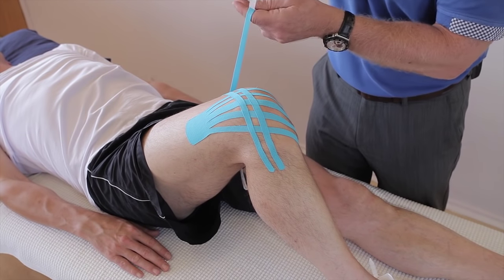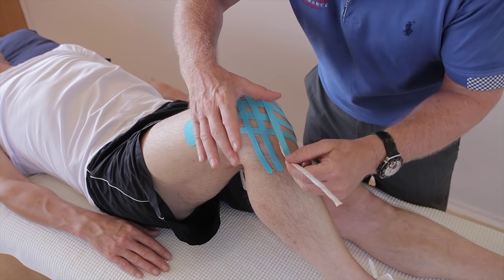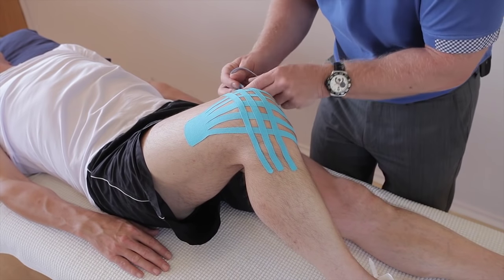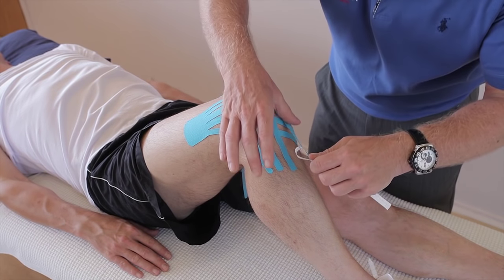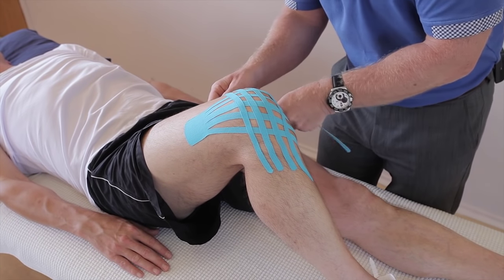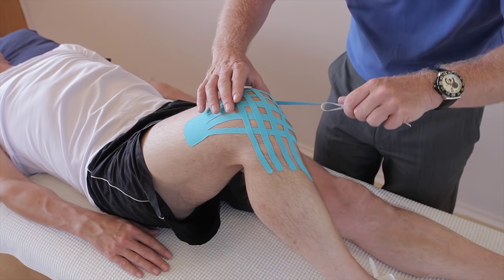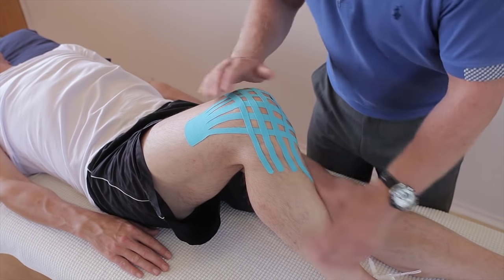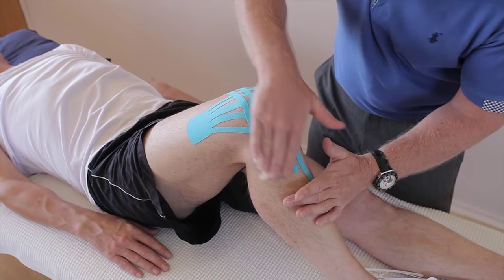I've also rounded off each of the fingers on the ends, because when you put your trousers on and off it might cause a lifting effect. So if you've got the time just to prep the ends, it might stay on for a bit longer. And then on the last one, using the back of the tape, heat activate the glue just for a few seconds.